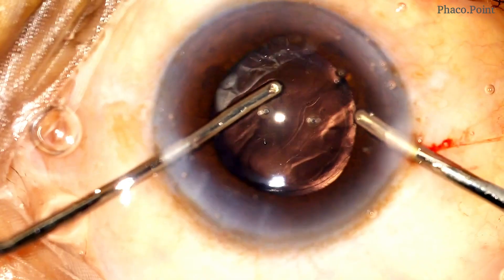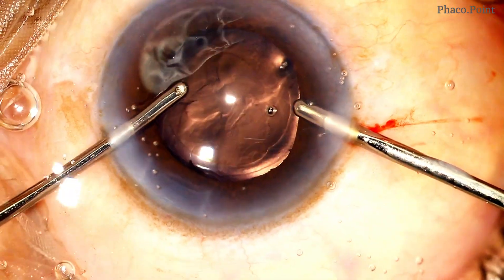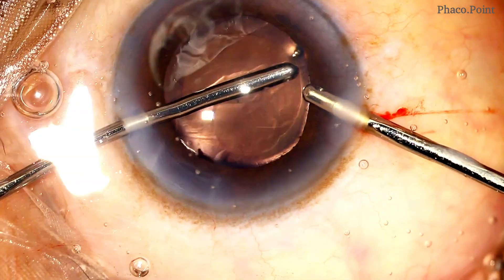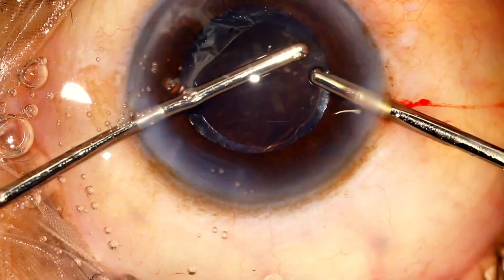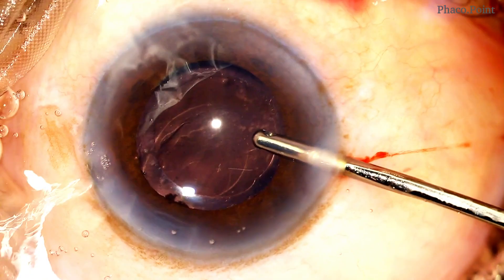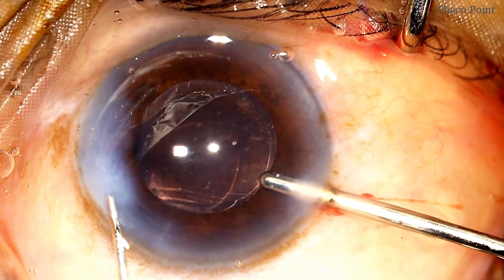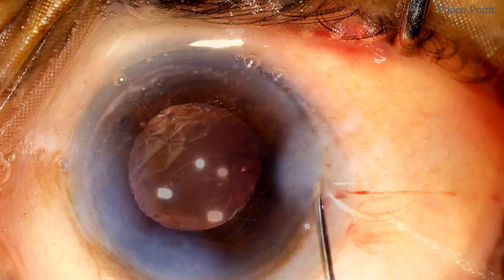With care and caution, the excess viscoelastic is now removed from the anterior chamber. You will notice that the tear in the posterior capsule has not enlarged at all. While maintaining irrigation in the eye, stromal hydration is performed at the paracentesis and the main incision, after which the irrigation probe is removed and that paracentesis is also hydrated.